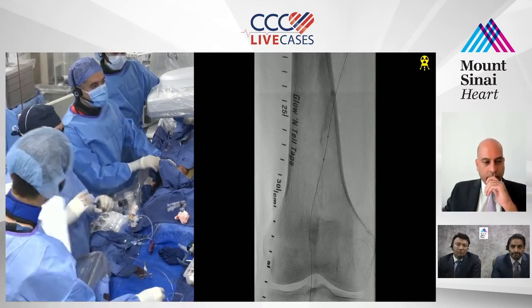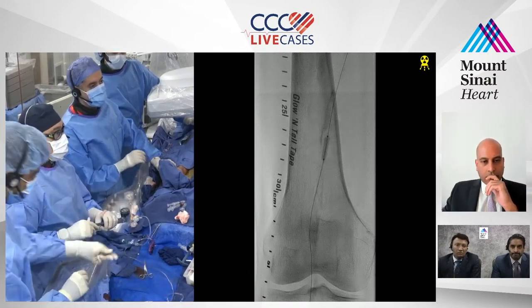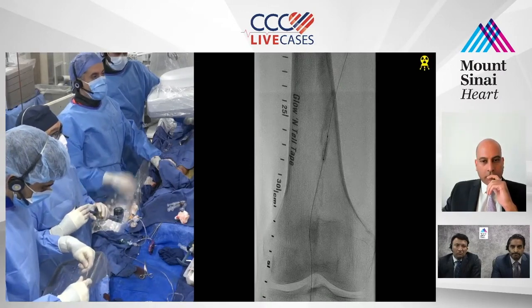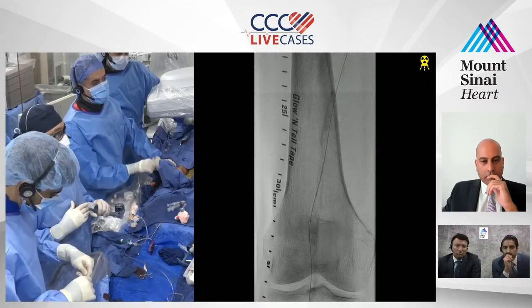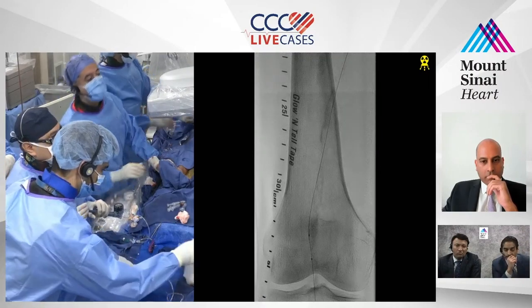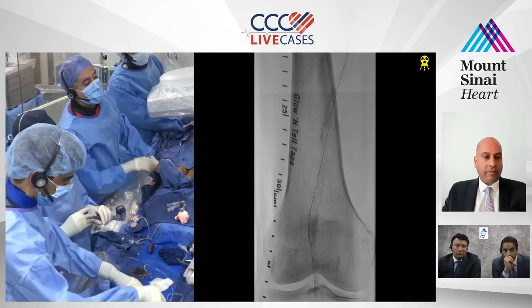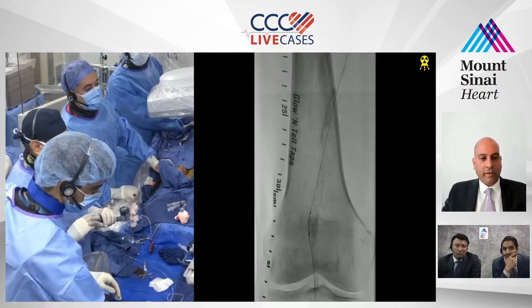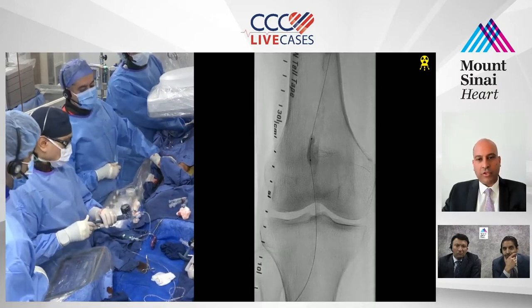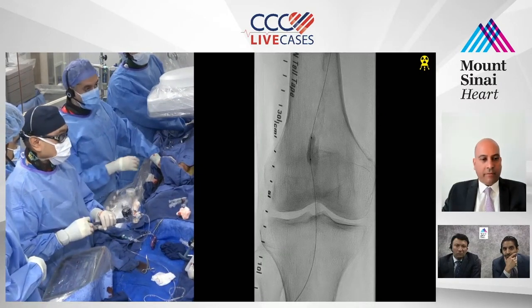That's good. Go up there. That's well expanded down. I think you're right. There are certain spots that have a lot of calcium, right? Oh, that spot right there. Yep, that's the spot. A little higher. Sorry, I couldn't see it. Like Raman said, part of the problem is that we're dealing with really extensive calcification in that popliteal artery. So how much benefit are we going to get?